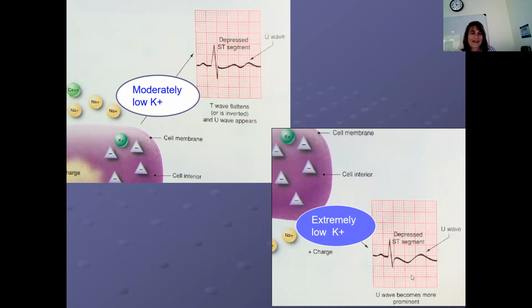Yeah. And here it almost looks like the T wave is inverted. As far as identifying it on an EKG, it is not an exam question. But do you have to know what changes there are with high potassium and low potassium? Yes. You don't have to identify it, but you have to know that, because it takes time to be able to identify these things on an EKG.